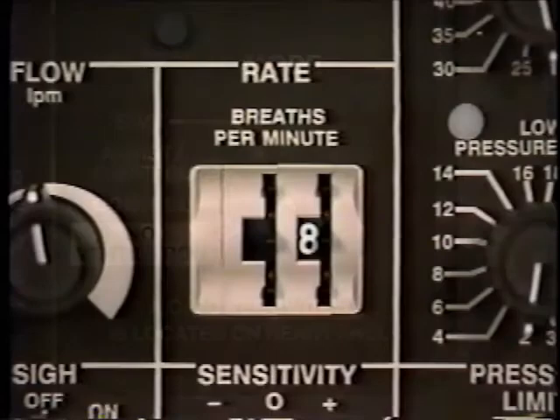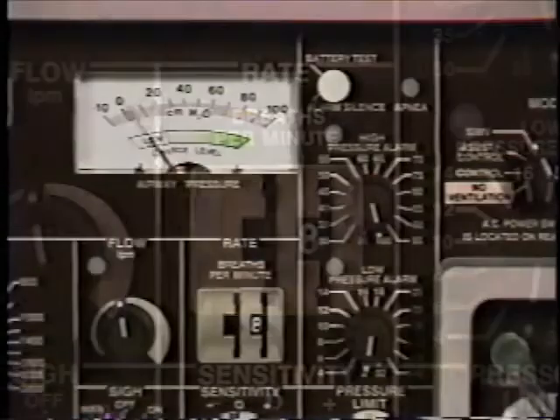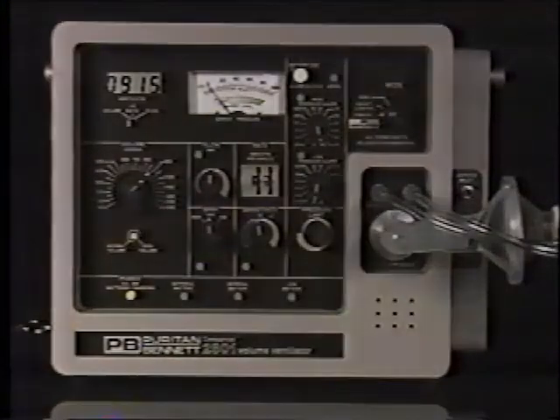In the SIMV mode, at settings of 8 or above, if the patient becomes apneic, no audible alarm will sound, but the indicator will flash and the patient will be ventilated at the set breath rate. Next is the pressure limit control.